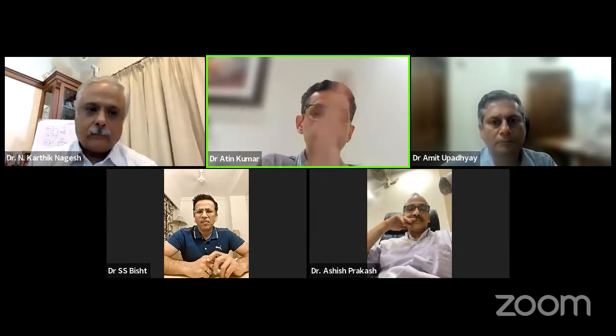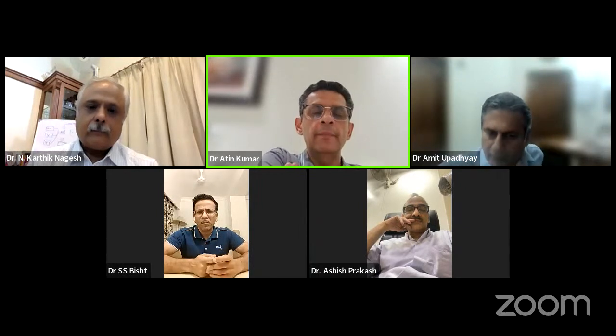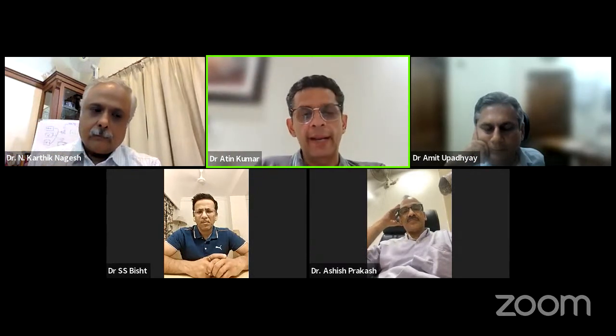If it is not showing diffusion restriction and if it has started showing volume loss and encephalomalacic changes, then you cannot time it. It could have been more than 10 days, 15 days, 1 month, 3 months, 6 months, 1 year, 2 years, 5 years, 10 years. I cannot time that on MRI, right?